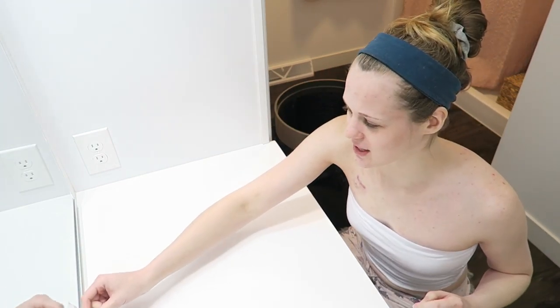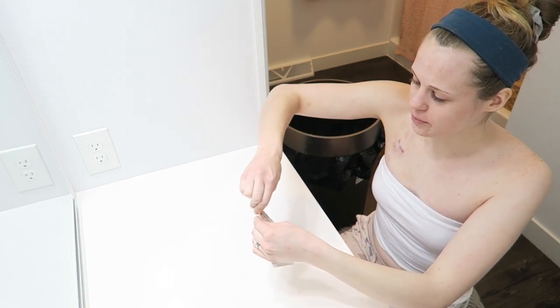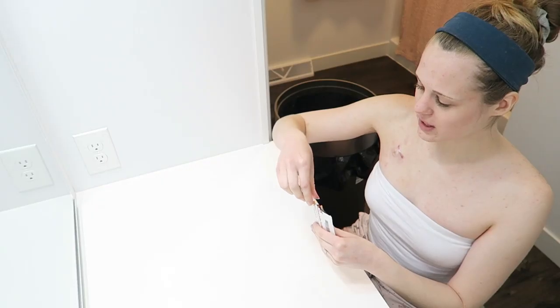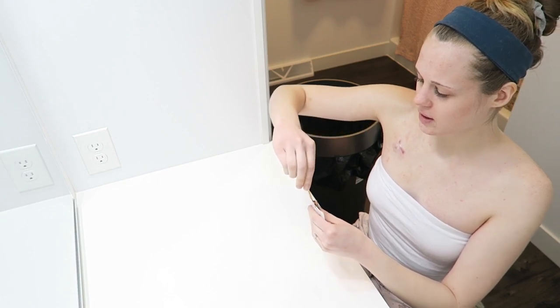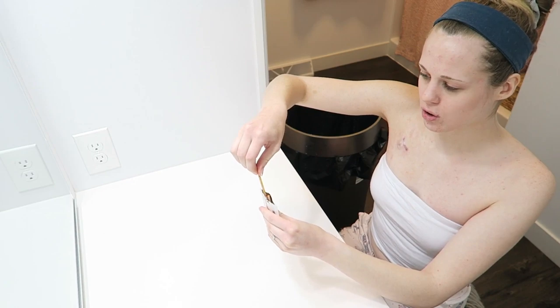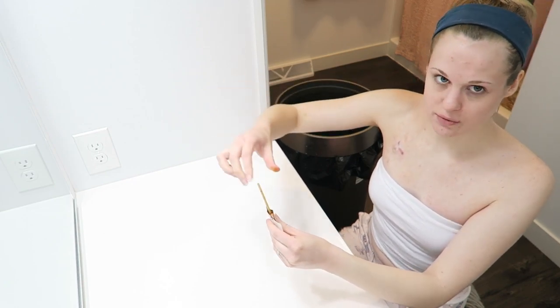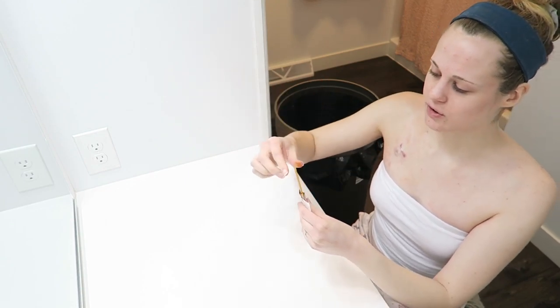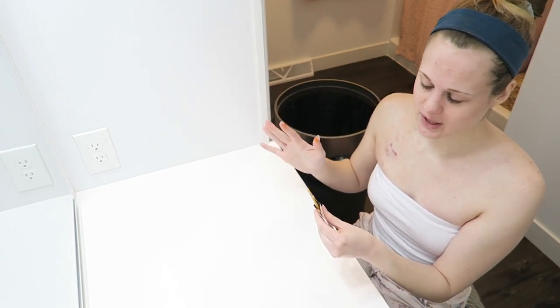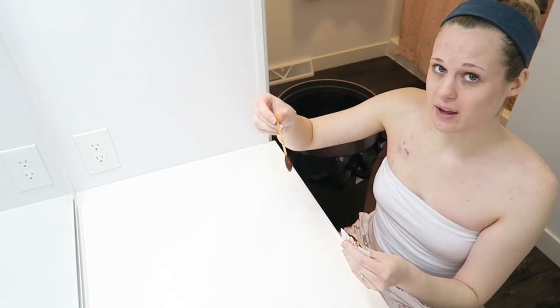So we're going to take the iodine right here and we're going to open it. This stuff is very messy. What I do is I grab the betadine and I squeeze it off because there is so much liquid in there that has been soaking in that if you don't squeeze it, it drips all over. Just so you know, the betadine is really, really messy. So now I have that.